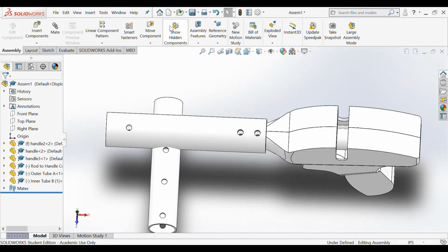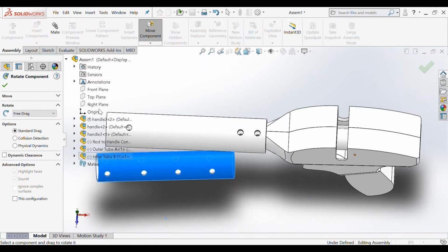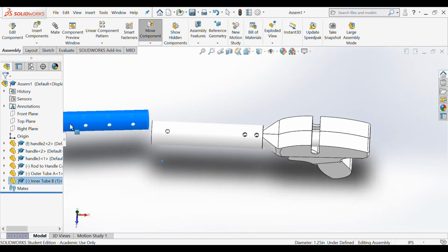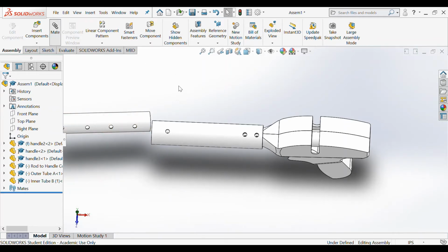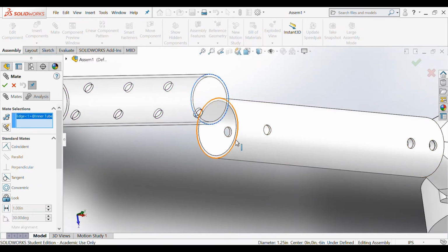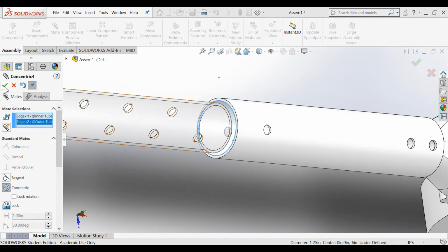Place it right there. I'm going to go on ahead and rotate it. We're going to make it this way, so this hole, which is closest to the edge, is going to be on the left-hand side, which is going to connect to our lateral hinge piece. So I'm going to go on ahead and move it over here, and we're going to do a similar mate strategy. So we're going to click on the outer circle and on the inner circle of the outer rod. We're going to make them concentric.